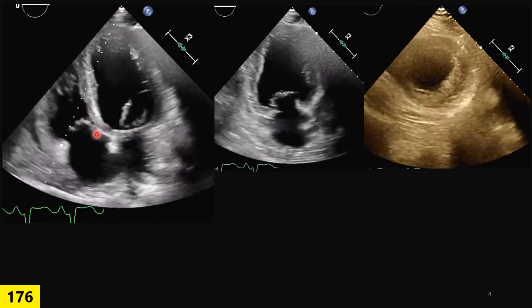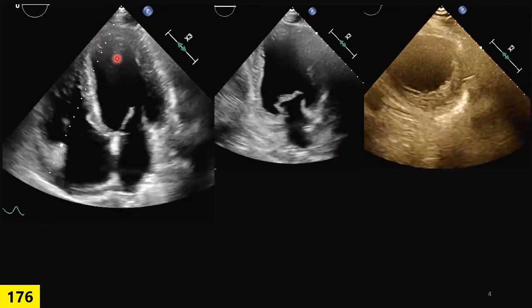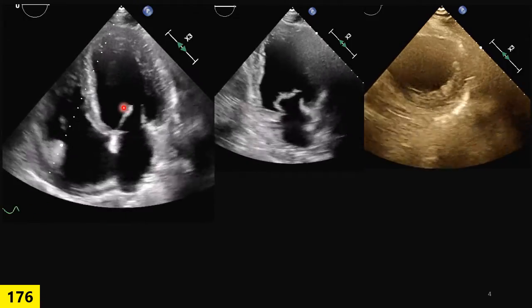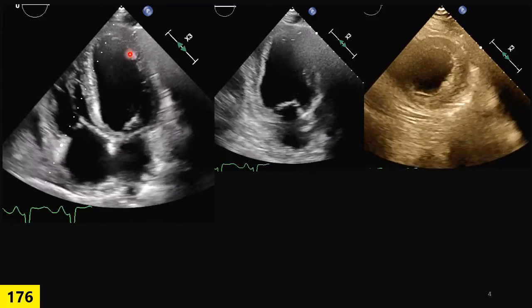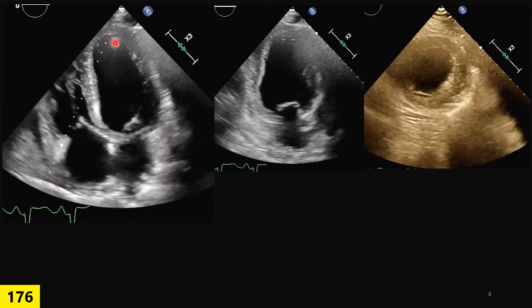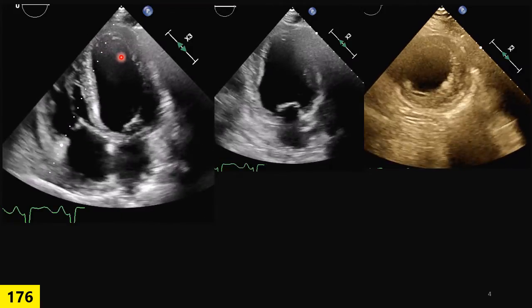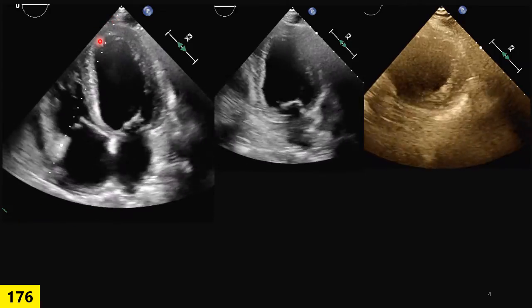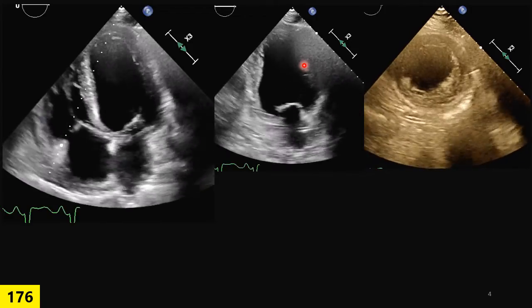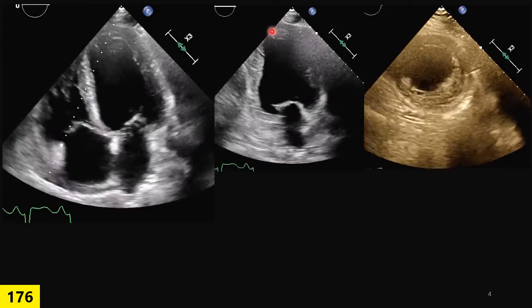However, some technologists and even cardiologists have lost touch with basic ultrasound principles. ECHO creates images from one plane, and the only way to not miss anything is to survey and scan through the entire area. For apical 4, for example, you must fan all the way up through apical 5 and even past the pulmonary view until you completely lose the apex, then fan down to the bed and get the basal view. For apical 2, fan left and then sweep toward the bed to survey the whole area.